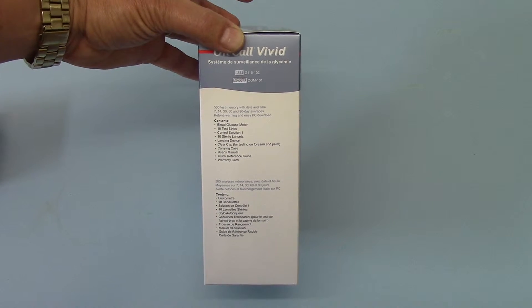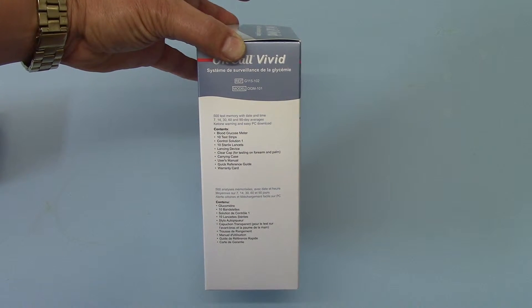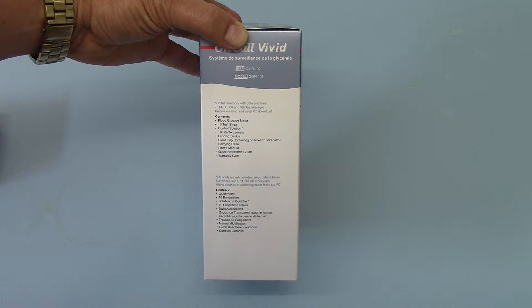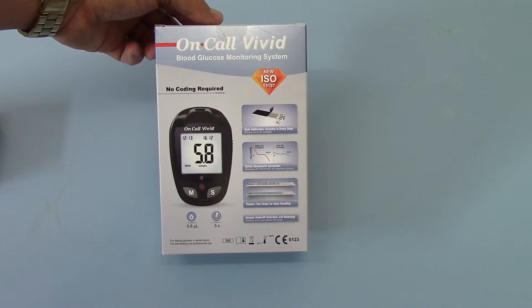It comes with 10 sterile lancets and an auto lancing device with a clear cap, which allows testing from over the palm, forearms, or thighs if you're having problems with capillary finger lancing. It also comes with a carry case, a user manual, a quick setup guide, and a warranty card. These units are warranted in the UK for 12 months from the date of purchase.